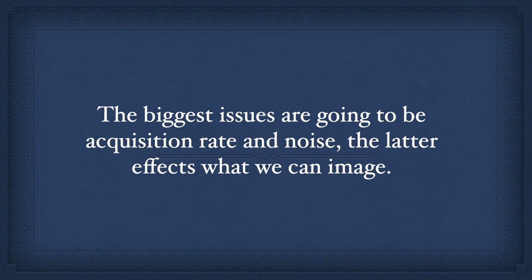And the biggest issues between these modalities are acquisition rate and noise. And noise doesn't seem that significant, but noise comes down to how you can penetrate, and the signal to noise ratio or the dynamic range, how well you see contrast and how well you penetrate. And we're only going to touch on some of this stuff.